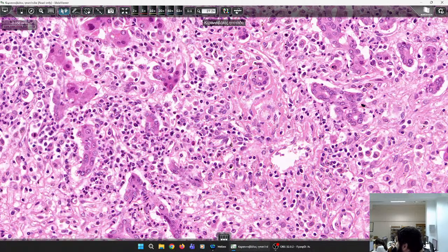In my case, there was not a single viable hepatocyte surviving.